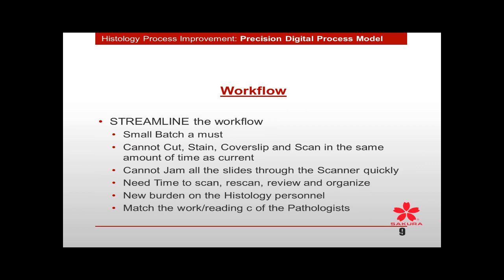And then you have to match the work and reading. I'm sorry, we have a typo; that should be capabilities of the pathologist. Even if you could buy 10 scanners and all of a sudden dump all this out, the pathologist can't read all of that. So your workflow always has to match the capabilities of your pathologist. Now that you've added digital, what is it? If they're able to read 7 or 10, maybe if they're derm paths, maybe they're reading 20 cases an hour and signing those out.